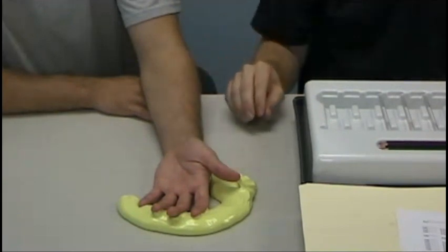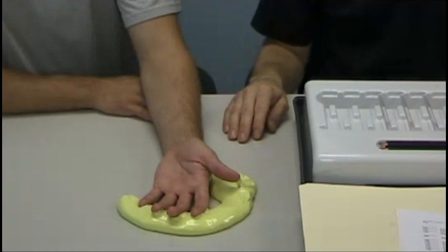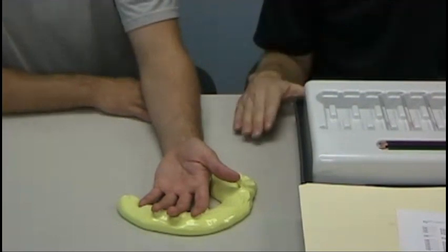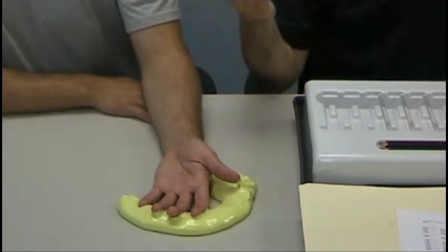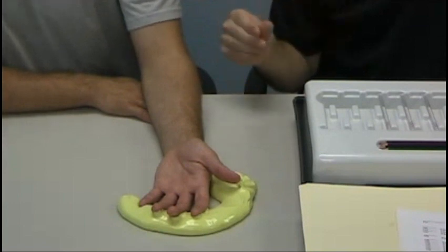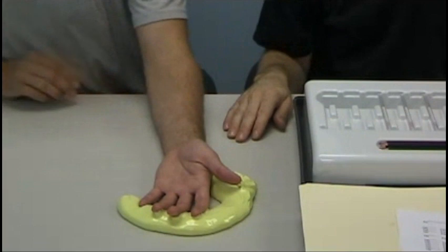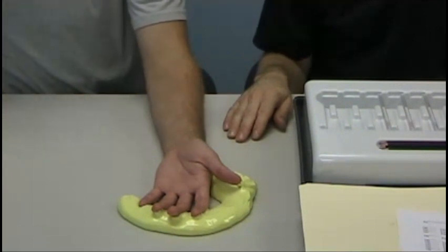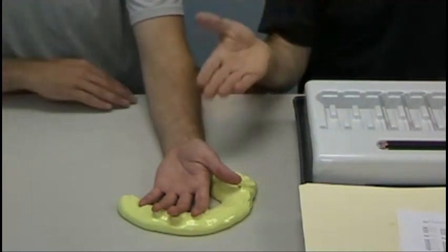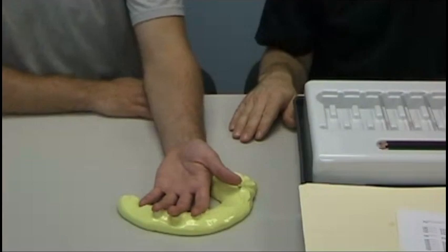That's pretty much how that works. That's the Simms-Weinstein monofilaments. Again, there is much more information about how the test is done in your readings. I just wanted to give you a visual to provide some context for that. We will also be going over these in class.